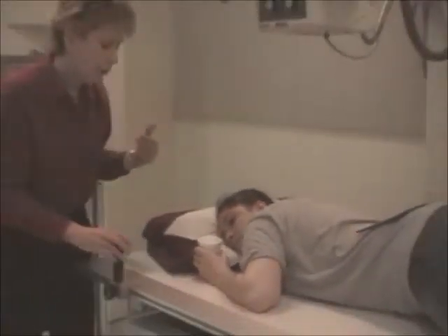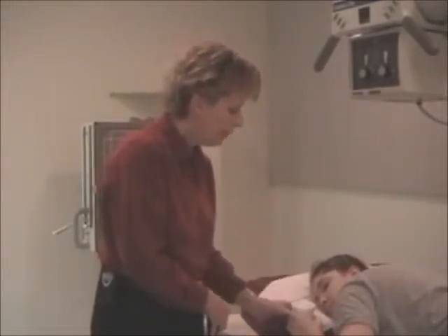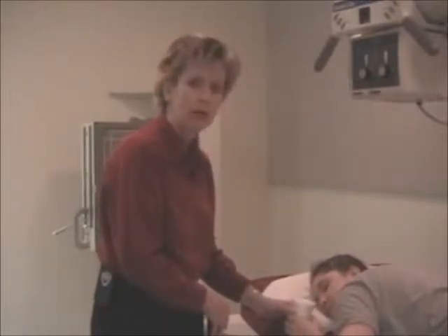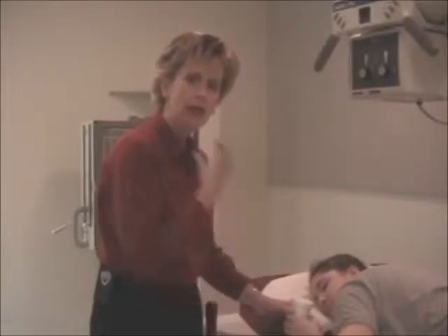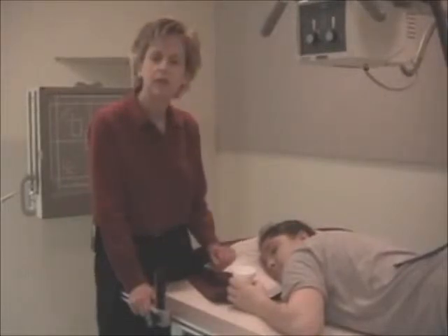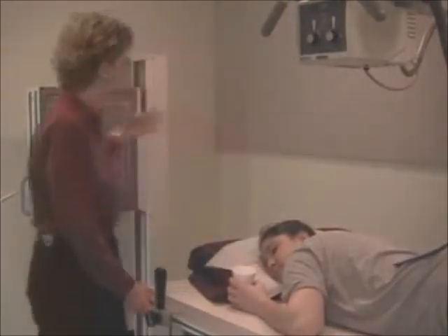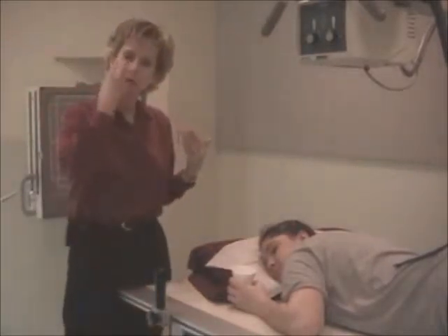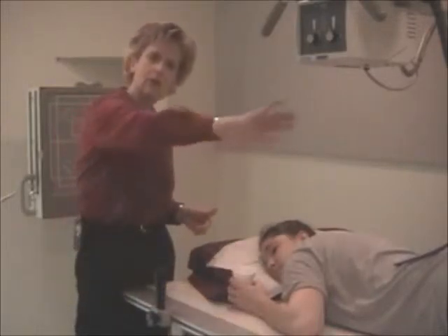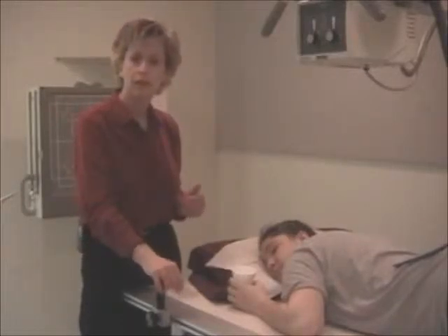The trick here is to gain your patient's cooperation. Explain to them that it's going to be necessary for us to swallow the barium that's in the cup, for them to keep drinking, and to try to take big mouthfuls and take big swallows in order to catch the barium in the esophageal tract. And we're choosing to do the patient in a recumbent position because gravity will assist us in it. You would position the patient exactly the same way at the vertical board, but as they swallow, the gravity will assist that barium going down faster, whereas when they're recumbent, swallowing the barium goes not with the flow of barium. So it's our recommendation that you do patients for esophageal studies in a recumbent mode.